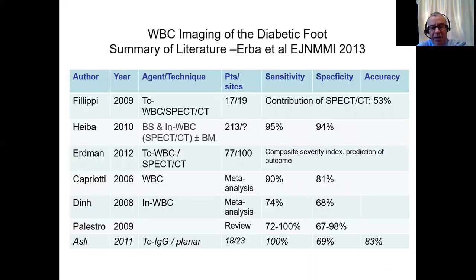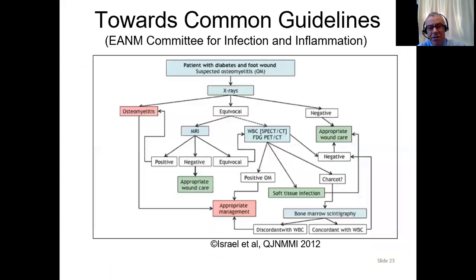Again, Professor Erba reviewed the different papers that had looked at SPECT-CT in various infections, and had found that the use of SPECT-CT was particularly useful in not only providing a reasonable sensitivity, but also good specificity, and particularly in feet, which are quite difficult to see where you are on just plain imaging.